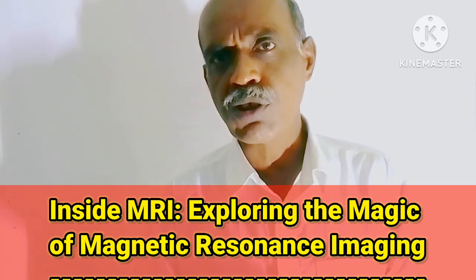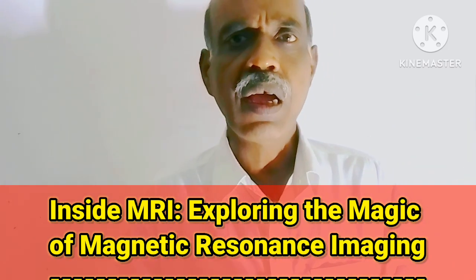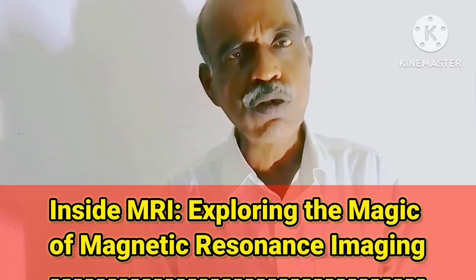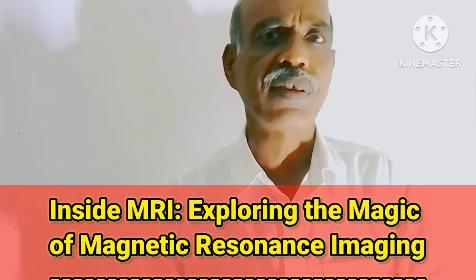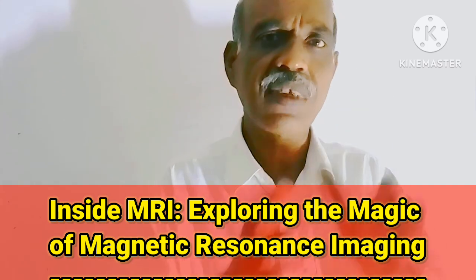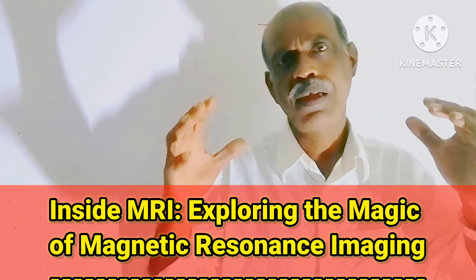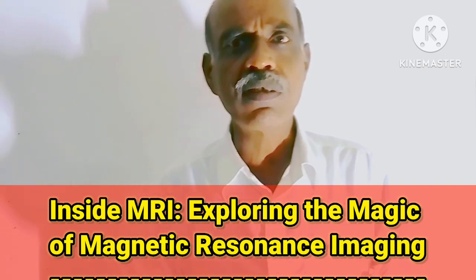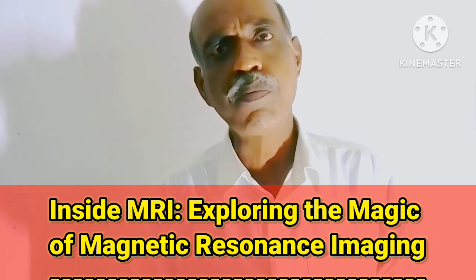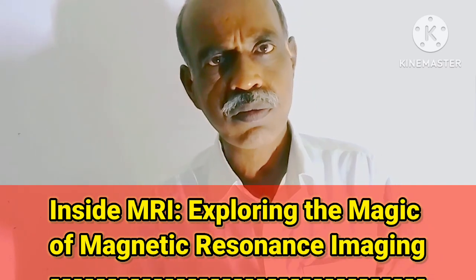So what is the procedure? In the equipment of MRI, there is one large magnet which can produce a constant magnetic field, and the patient is kept inside that machine. You know that the human body is composed mainly of water, 70% water. Body fat also contains hydrogen atoms.